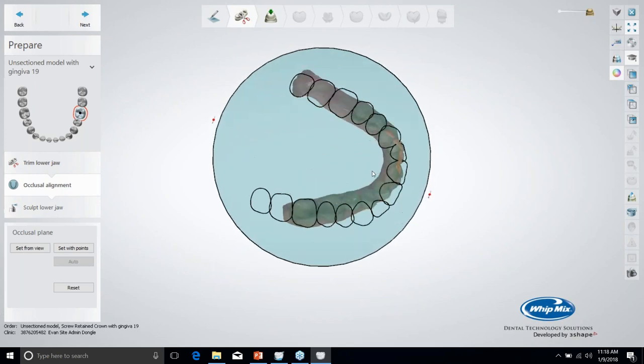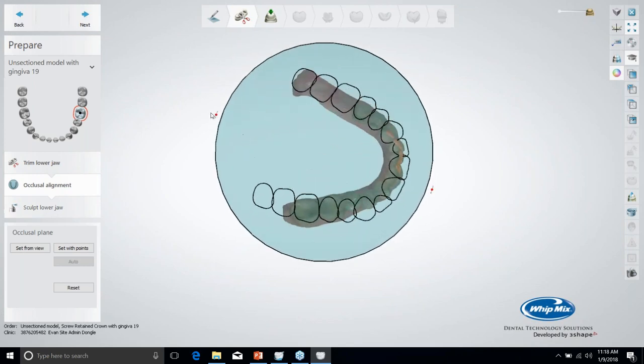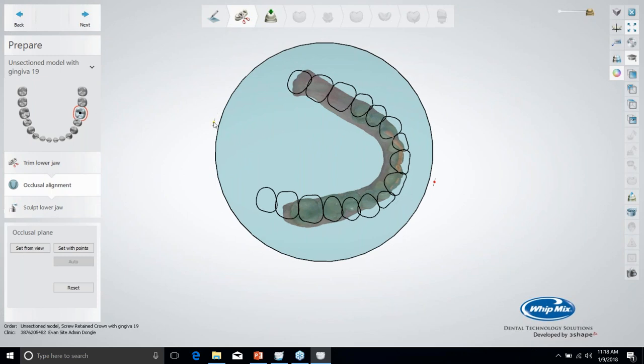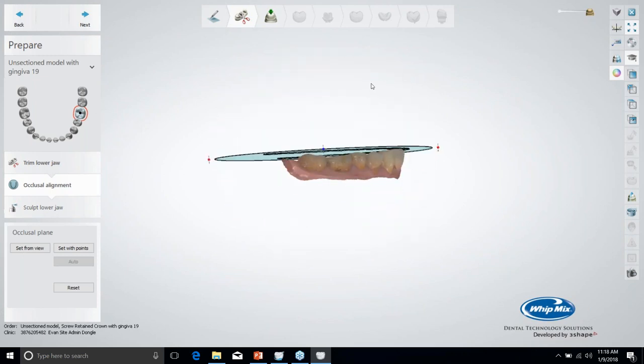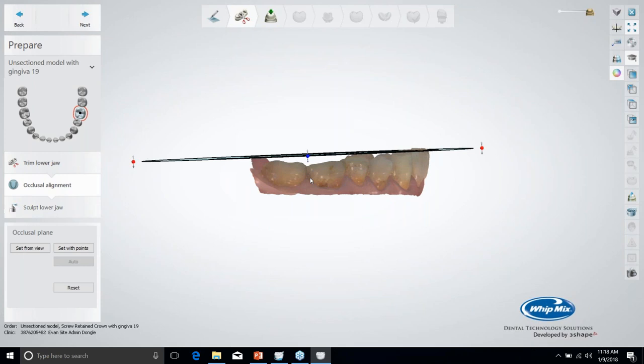If you're getting third-party intraoral scans, especially in raw STL format, then you may have to rotate this. The reason you want to line this up now so it follows the occlusal plane is that if you make a printed model, this is going to determine how the model base is oriented to the scan. If this is off by a lot, you're going to end up with a really bad looking model, as well as one that may take a long time to print.